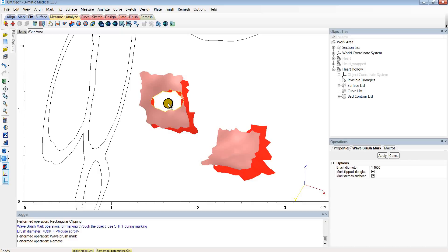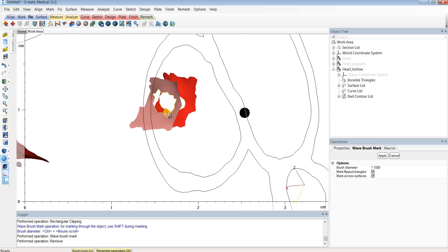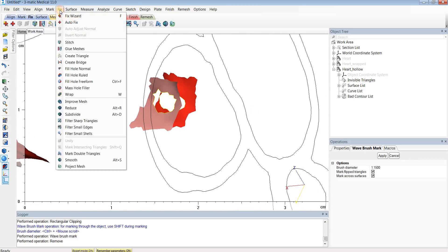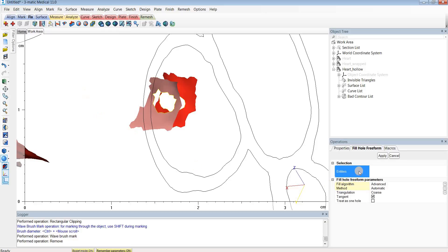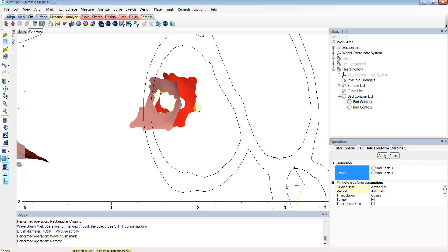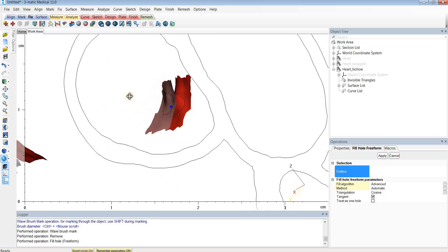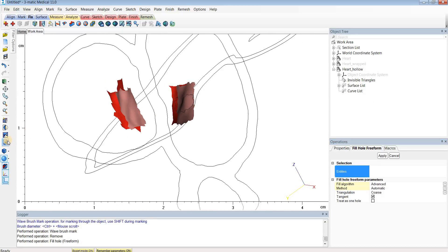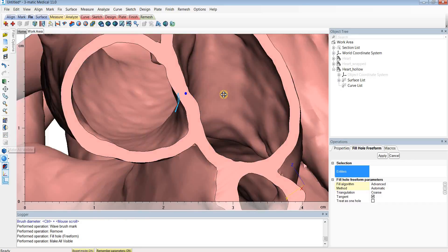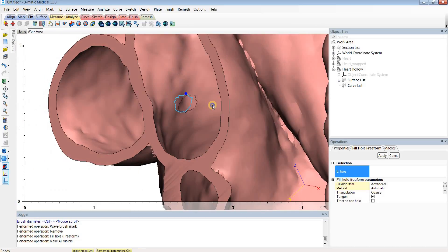The marked triangles will appear in orange, so go a couple triangles from the edges of these holes. Once you've marked that area, hit Delete on your keyboard to delete those triangles. After deleting, we have two holes left over. To fill them in, go to the Fix menu and choose Fill Hole Freeform. Select the outer contours of the holes, hit Apply, and it'll fill in those holes. Hit Make All Visible and the rest of the model will appear, with a wall between them and no holes.